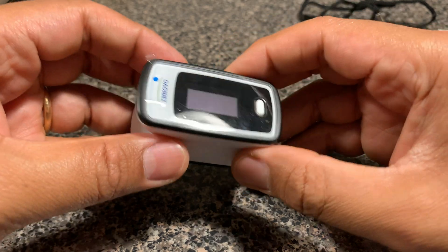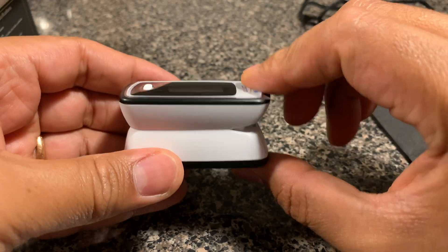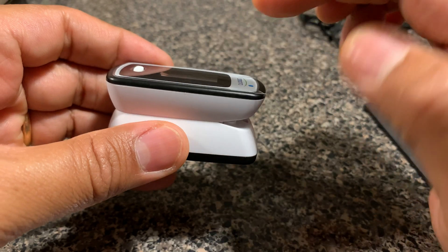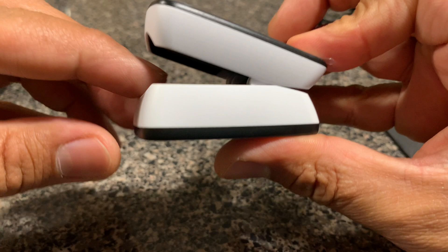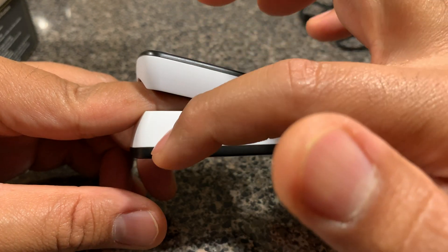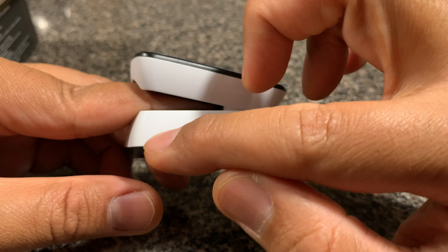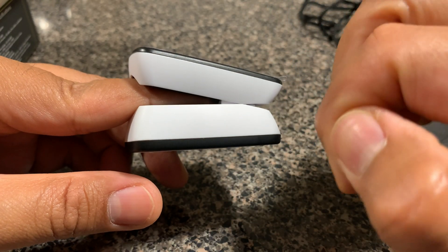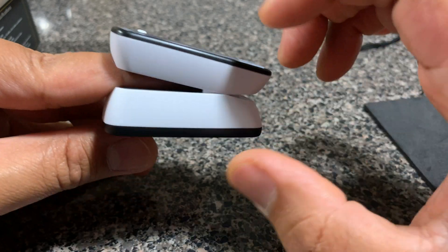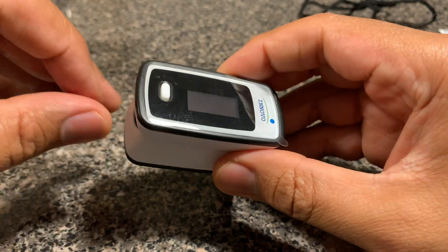There are a couple of things to tell you about how this unit actually works. Basically, there are two light signals emitted from the top portion: an infrared light and a red light that pass through the finger. There's a sensor at the bottom that picks up the light that gets through, and there's software with a processor that calculates how much light was sensed, then uses an algorithm to give you the SpO2 reading and pulse rate. When taking any measurement, errors can be introduced — for example, if ambient light where you're taking the measurement is too strong, the unit will factor that in during the calculation.